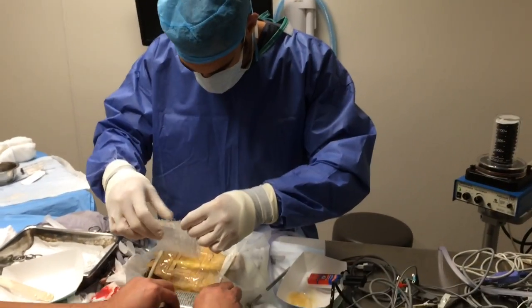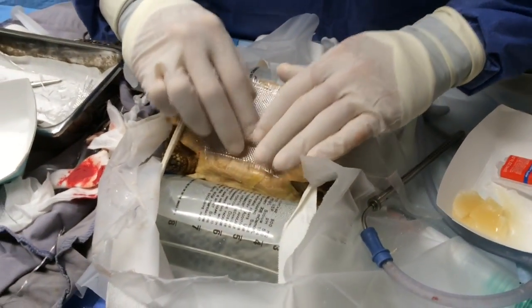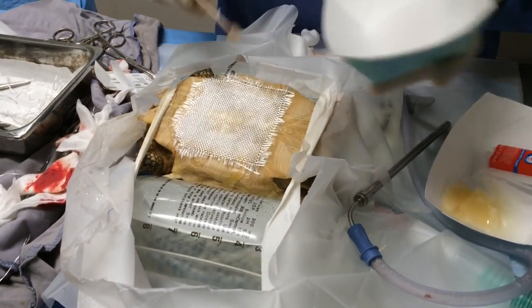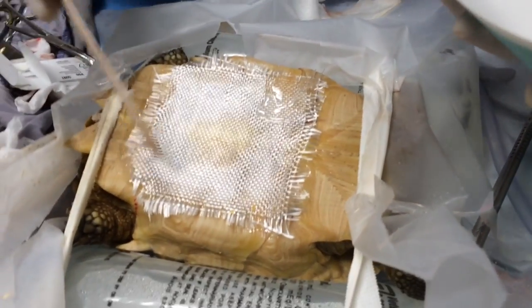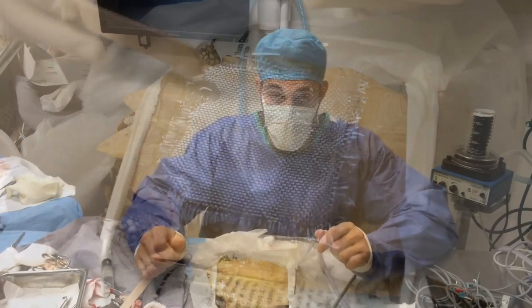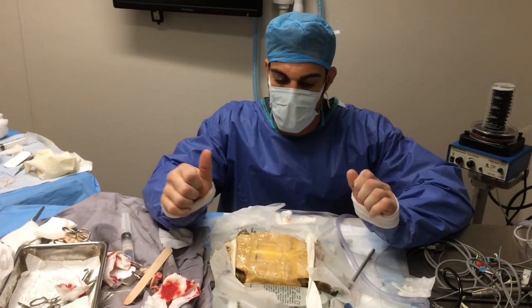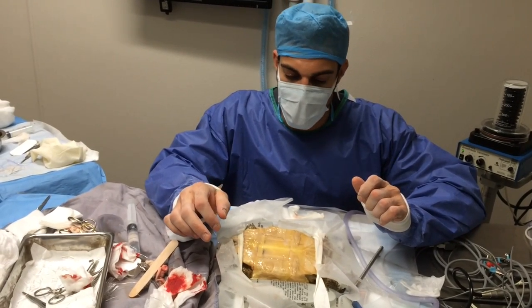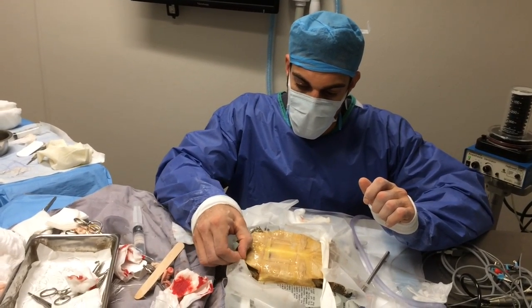So that's laid down. I'm just going to lay that down — excellent, that's a good size and shape, that's where we want it. Now we're just going to paint epoxy on top of that. We just applied all the epoxy and fiberglass and here's our final product. It's going to take a little bit more time to dry, but that's pretty much it. You can barely tell where the shell was taken out. It's a pretty neat procedure. We're going to wake this little tortoise up and get her nice and warmed up.